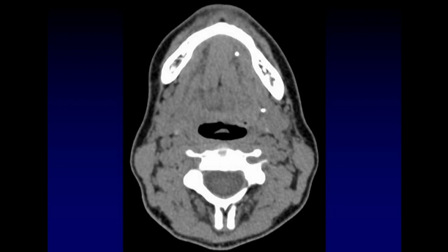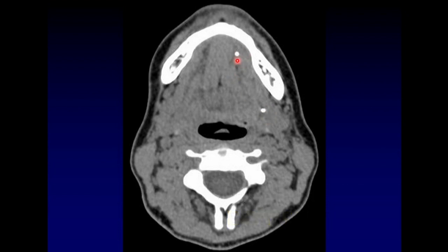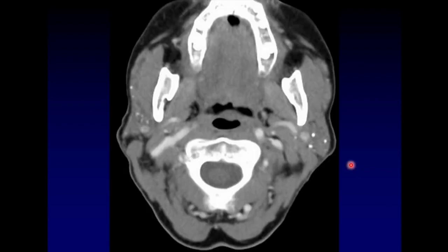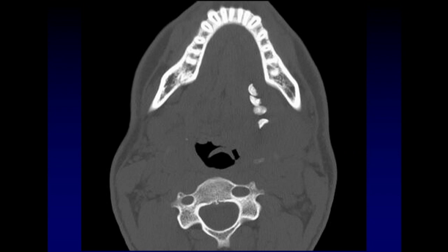Here are the bottlenecks where we should be particularly looking for stones. One is at the hilum of the gland, where we transition between the intraglandular and extraglandular duct. The other is at the puncta, just before it drains into the mouth. Those are our two bottlenecks — that's where to really look hard for stones. Sometimes stones are scattered throughout the gland and are an incidental finding in asymptomatic patients. Sometimes patients have extremely large stones; in fact these stones are fractured, but the fact that they're lined up along the expected course of Wharton's duct clues us in to the specific diagnosis of sialolithiasis.